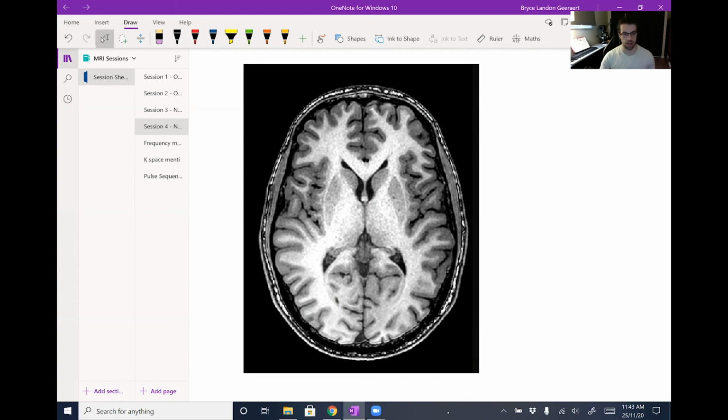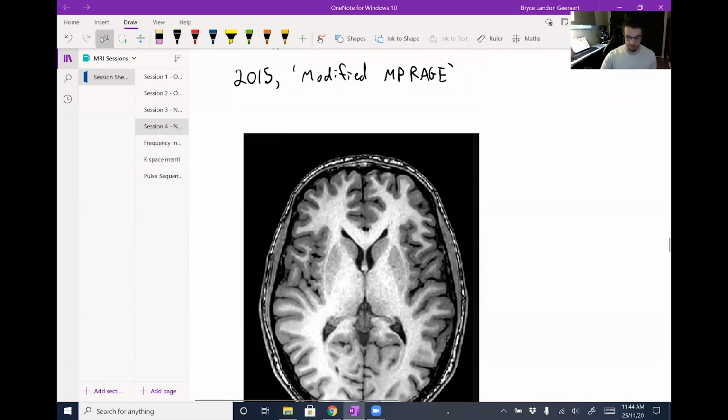Very, very cool. And that helps to allow us to collect greater contrast in tissue of interest while removing signal we don't want. So that's also used in T1 imaging to make sure that even though we have our steady state NMV that's lower magnitude than it could be, we're really only collecting signal that we care about. Then we're using that signal to outweigh the noise and increase contrast with surrounding tissue like CSF, which we want to be dark so that we can clearly distinguish the brain.